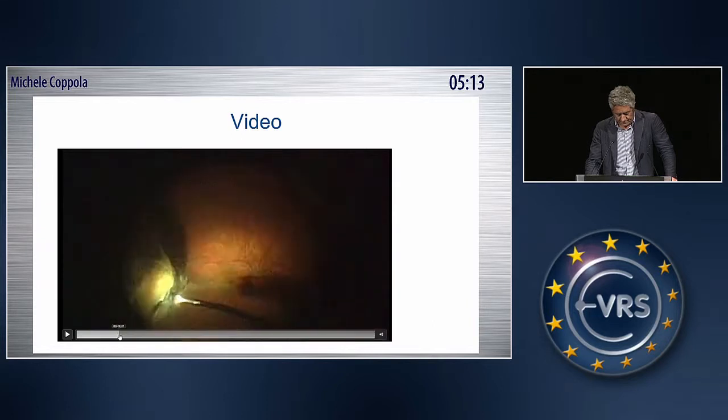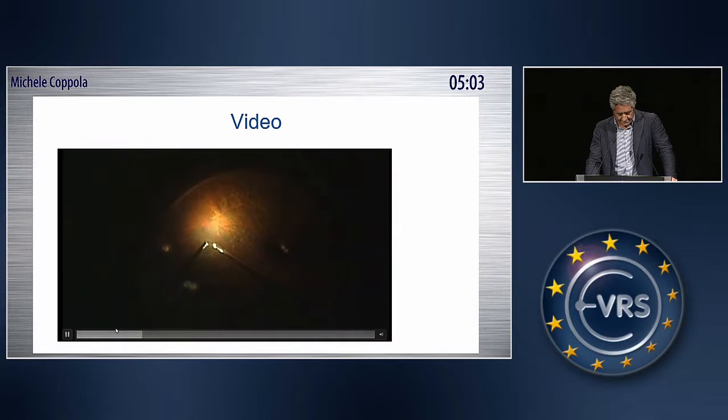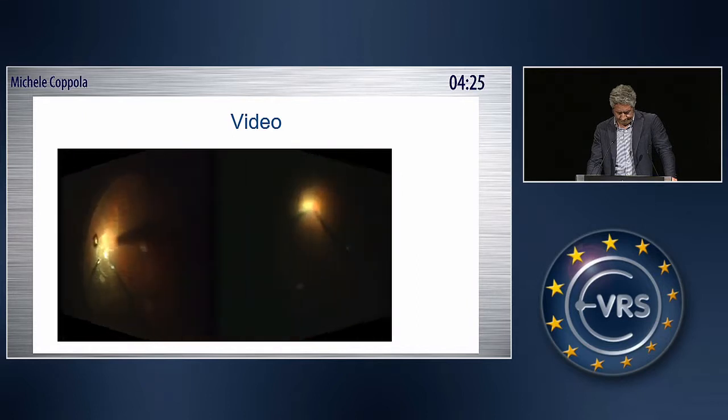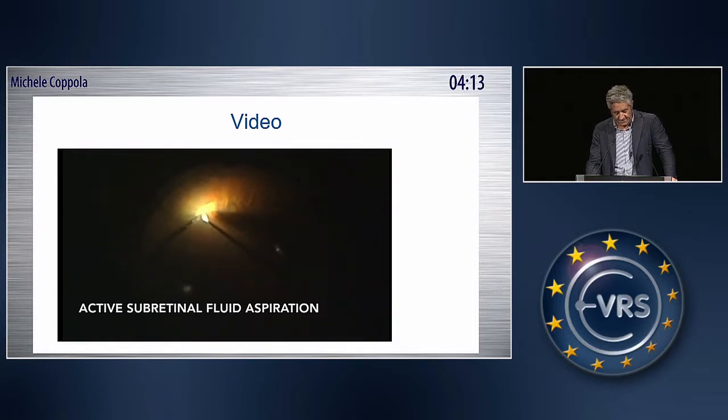Okay, we go forward a little bit. Okay, this is the moment when we induce the posterior vitreous detachment. Okay. Finally we found the retinal hole, in the inferior part of the retina, and here now we are doing an active subretinal fluid aspiration.